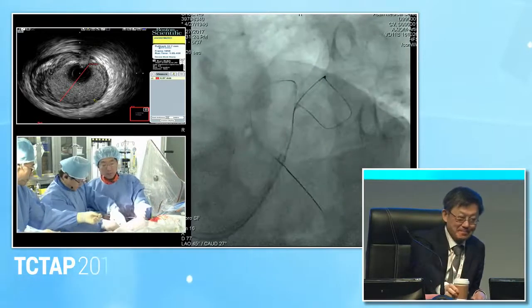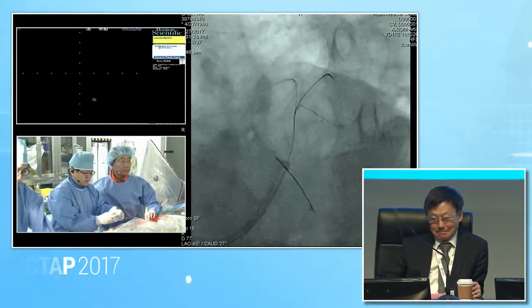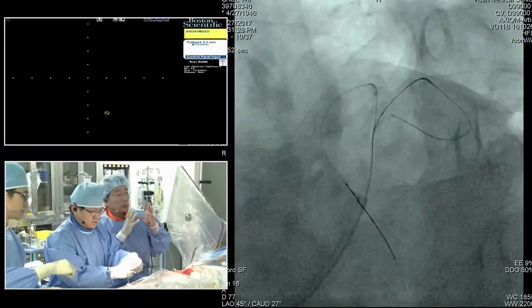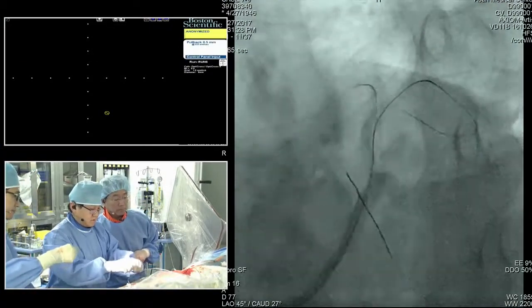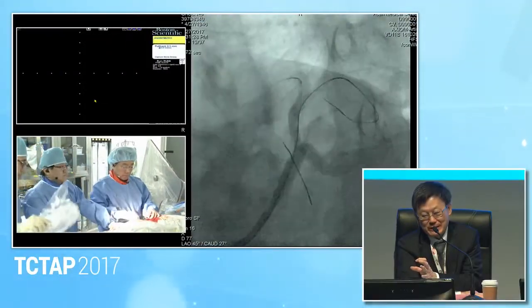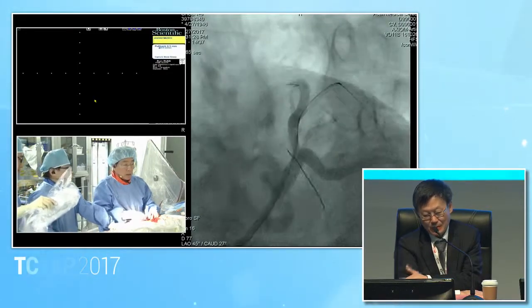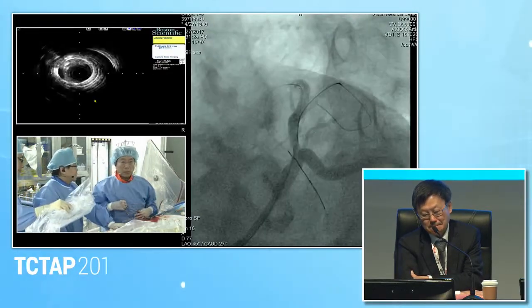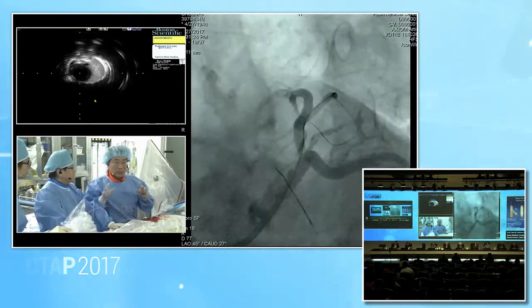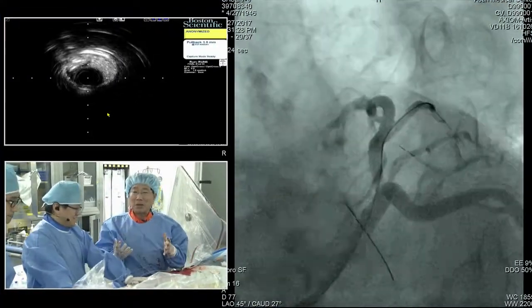The diagonal branch first, 2.75. This is the diagonal branch, high pressure inflation. All right. Do we have any IVUS data regarding this kind of non-Neffman bifurcation, for example, if you want to achieve a minimal stent area, for how much for the diagonal do you feel satisfied? You don't have the data? No. In a case of LAD diagonal branch or OM branch, obtuse marginal circumflex bifurcation, it is not a big deal in our lab anyway.